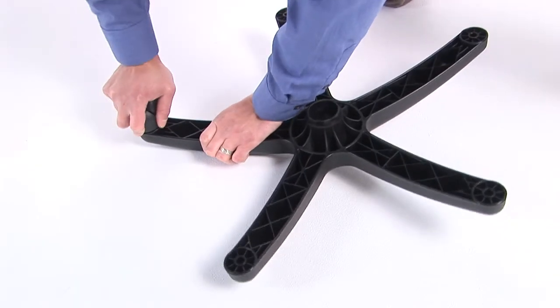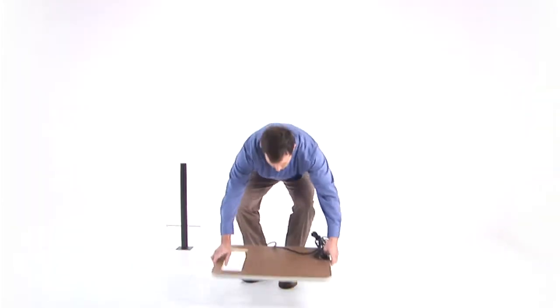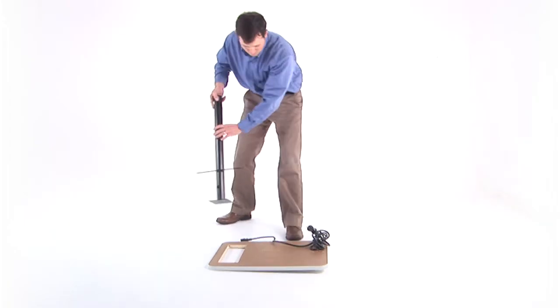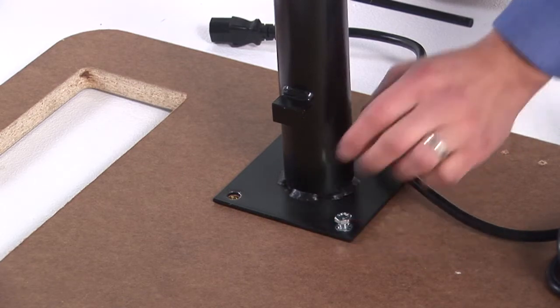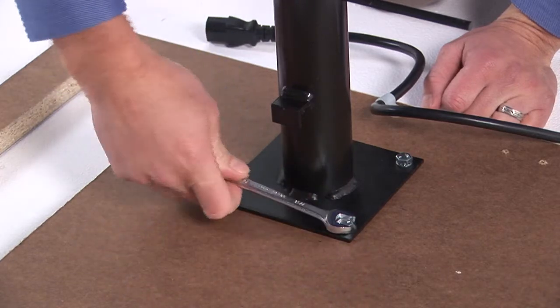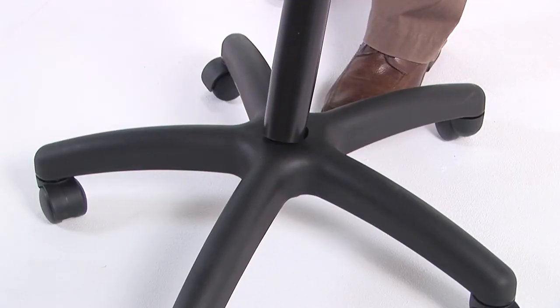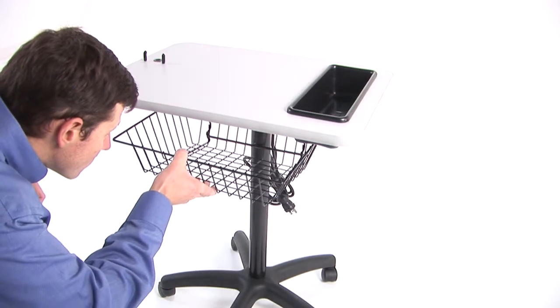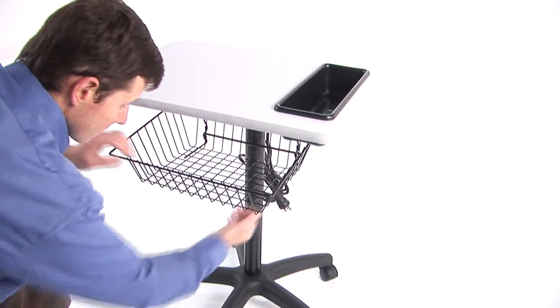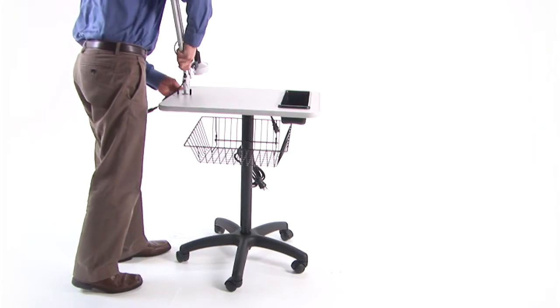Assembly of the ultrasound cart can be achieved in a few simple steps. First, insert the casters into the five holes on the bottom of the base. Then lay the tabletop on the floor with the finished gray side facing down. Position the cart posts on the tabletop and align the four holes. Place the lock washers on the four bolts and tighten them using a 7/16-inch wrench. Turn the tabletop right side up with the cart post pointing downward. Place the cart post into the base and firmly push down. Insert the utility tray and snap the metal basket into place. Insert the ultrasound arm with the steel washer into the tabletop and position the generator to your preference.